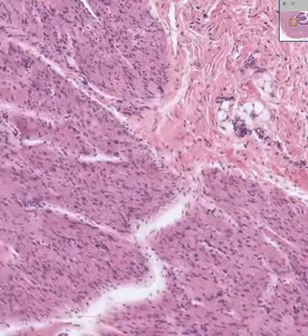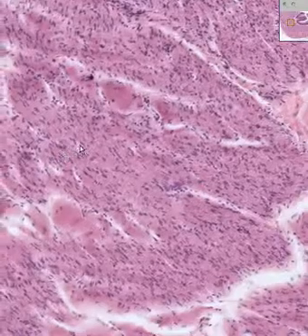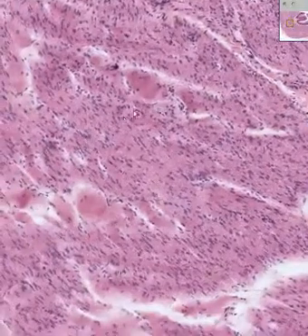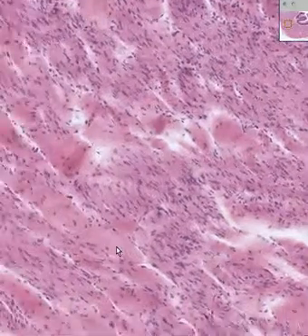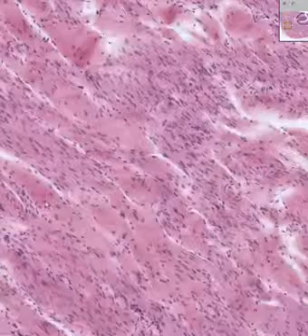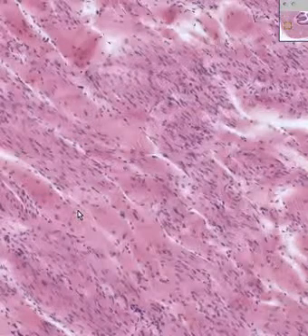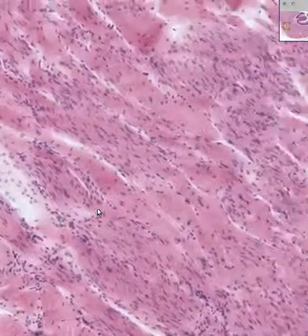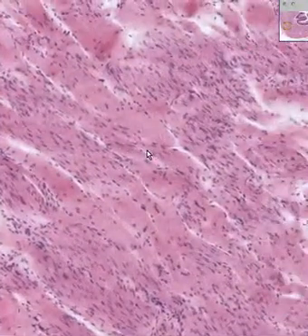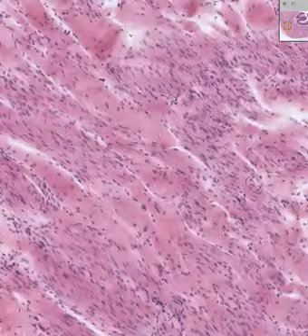And then here are your various smooth muscle layers going longitudinal and circular. And sure enough, I think we have some skeletal muscle fibers mixed in here. So we were probably cutting this from the top part of the esophagus rather than the lower or inferior portion. That's beautiful. It's really the only place in the body, I think, where you can see a nice, beautiful intermixture and comparison between skeletal muscle fibers and smooth muscle fibers.